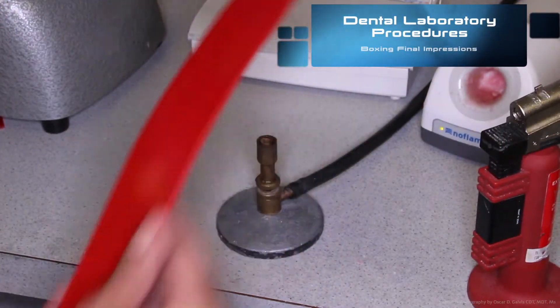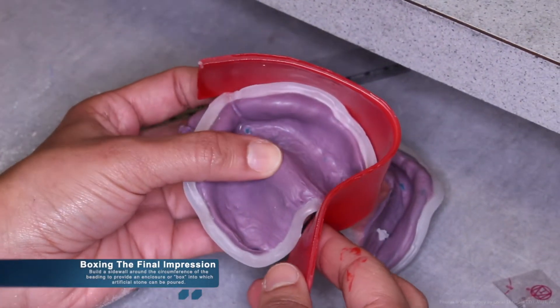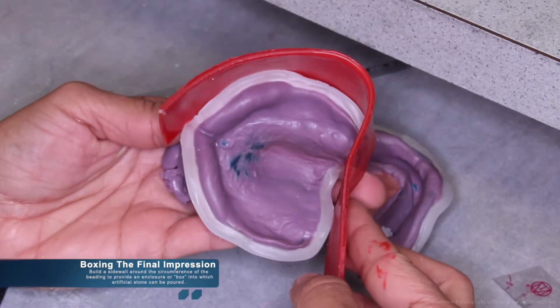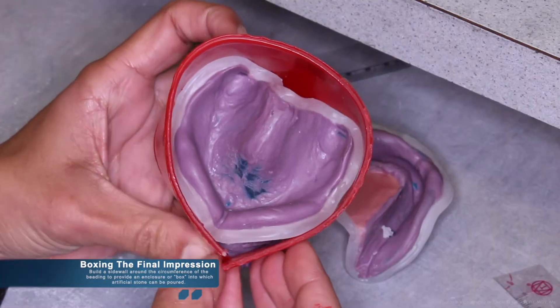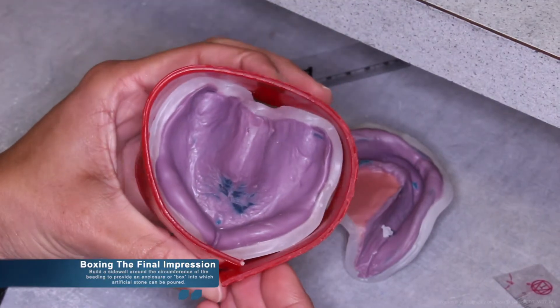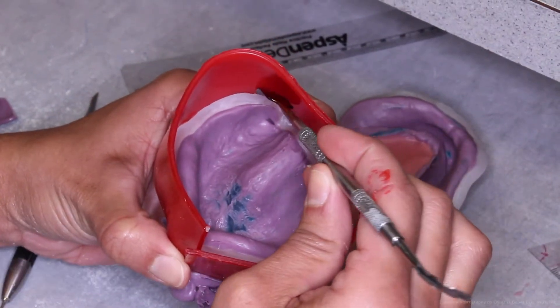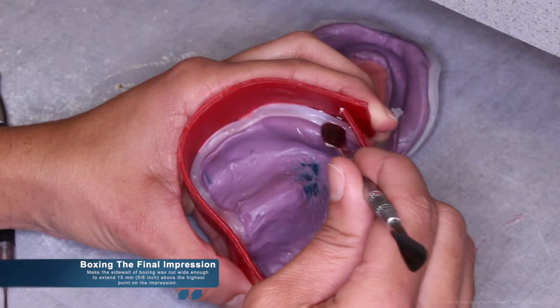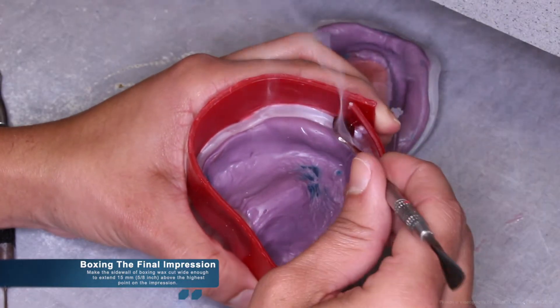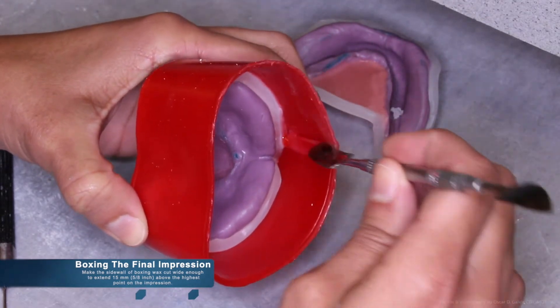Once beading the final impressions is complete, we can now move to boxing the final impressions. In order to do so, build a side wall around the circumference of the beading to provide an enclosure or a box into which artificial stone can be poured. Boxing wax is made specifically for this task. It is easily manipulated, especially under heat. Once the boxing wax has been placed around the beading wax, make the side wall of the boxing wax wide enough to extend 15mm above the highest point of the impression.